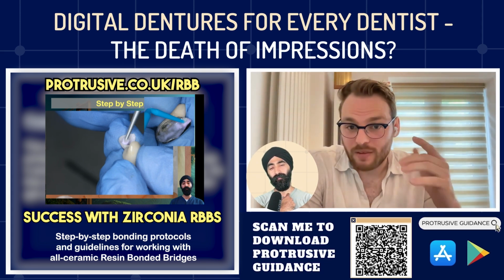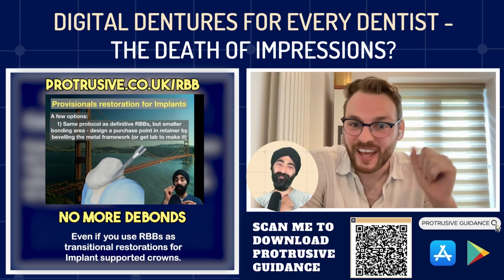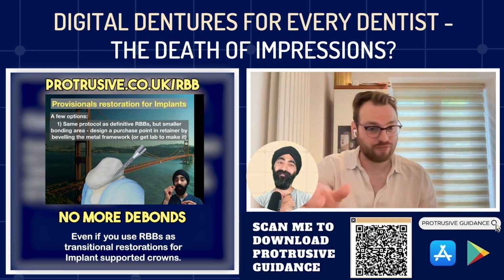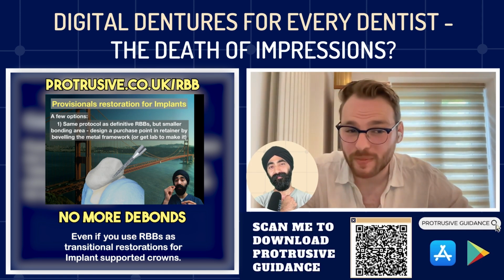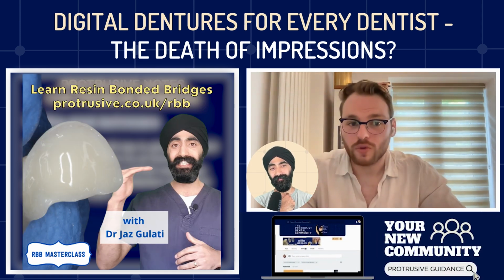And again, I'm going to say, we're not committing yet. You go away for 2 weeks and wear this at home, and then you tell me you're happy. And then you've got consent, right? You can just say, you told me you were happy with this. You can wear this, you can eat with this, you can try it all out properly. So that's a really, really cool aspect. And that reference denture, for me, is the gold standard.